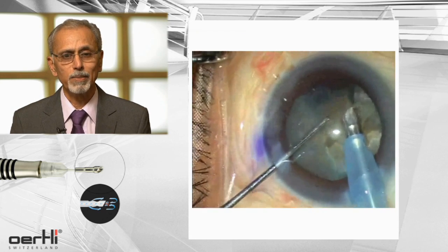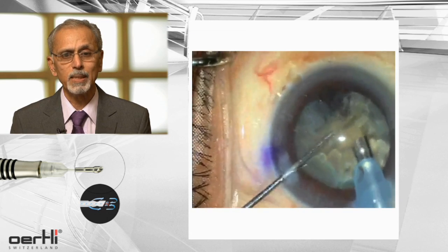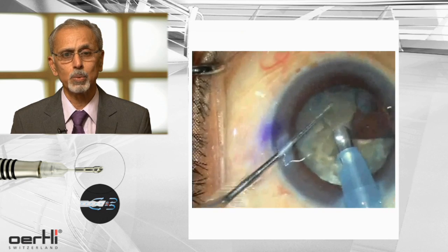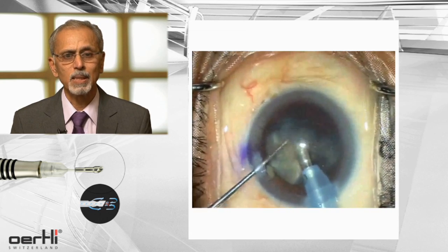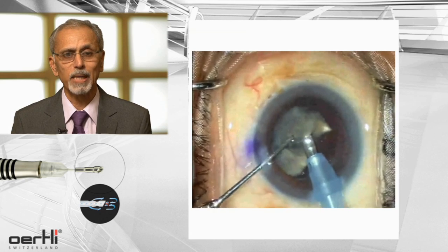Whenever you want to emulsify, your FACO-Tip has to get occluded. So turn your bevel to the side where you wish to emulsify the nuclear fragments. And as you reach the final fragments, sometimes it is better to lower your FACO parameters.